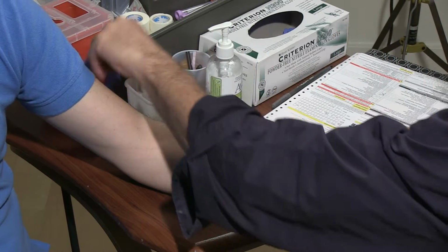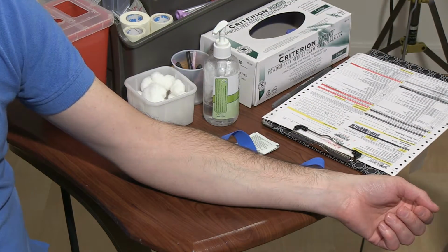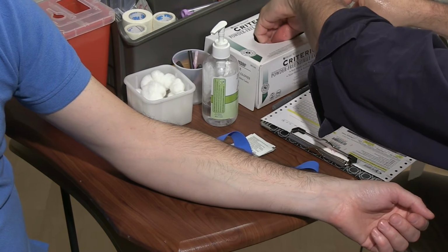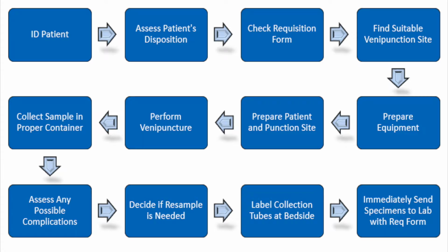physician has ordered. The student will introduce him or herself and his or her role as a medical assistant. The student should also identify and introduce the clinical supervisor present for this invasive procedure. The student will explain the purpose of phlebotomy to the patient and the steps involved. As part of the initial introduction, the student should confirm the patient or model's understanding of the procedure and elicit their verbal consent to proceed.